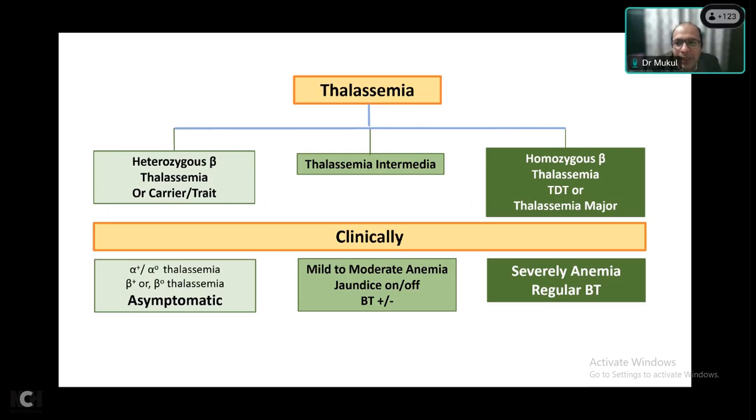So what we rely on in practice is especially a microcytic hypochromic picture, a very low MCV and a high RBC count which is not corresponding to that MCV. That is a clue which helps us in determining whether the patient has thalassemia trait or not. Invariably, whenever there is the slightest bit of confusion, go for both HPLC and serum ferritin test.